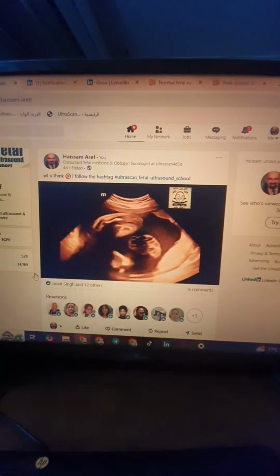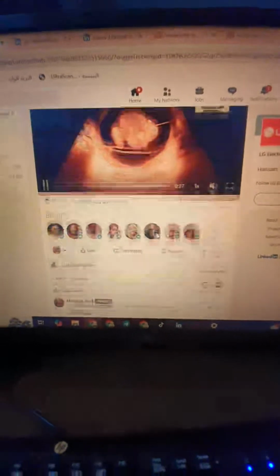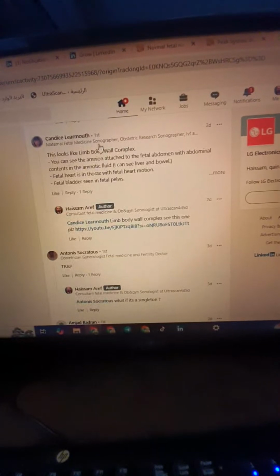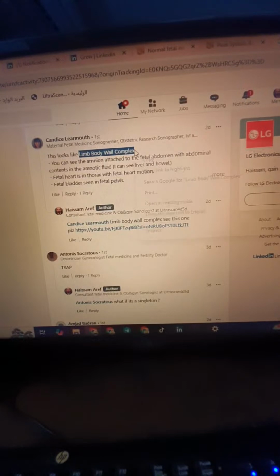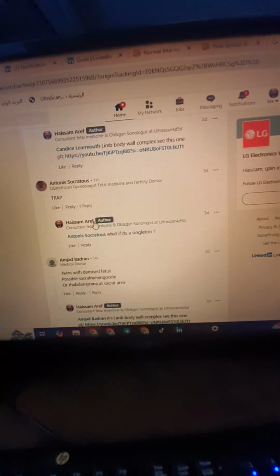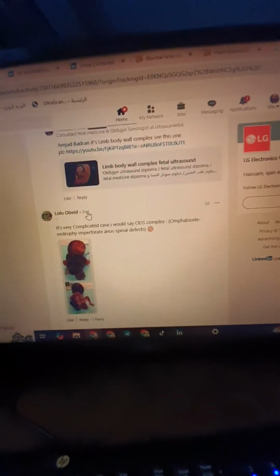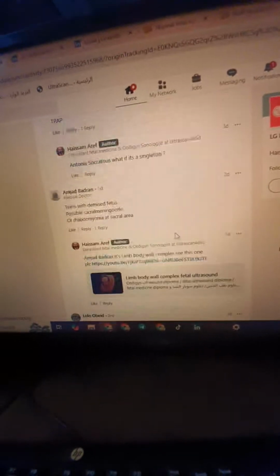Let's go back to our other cases. We will find another case here, which is a case of limb body wall complex. Limb body wall complex, bravo Candice. No, Dr. Antonius, it is a case of limb body wall complex, like Dr. Ala said. It's a limb body wall complex, my friends.